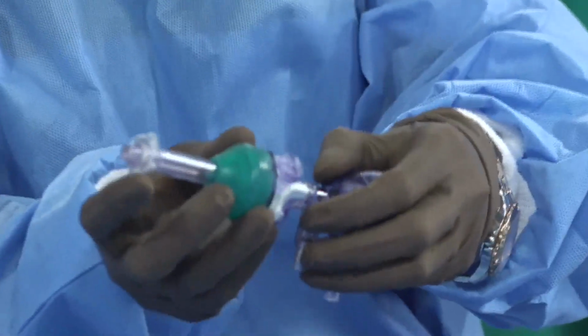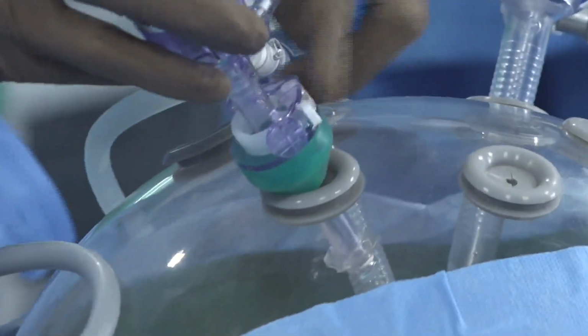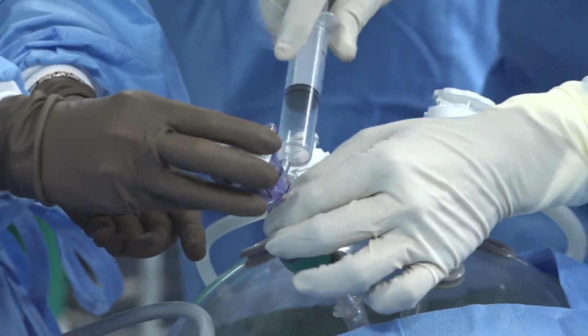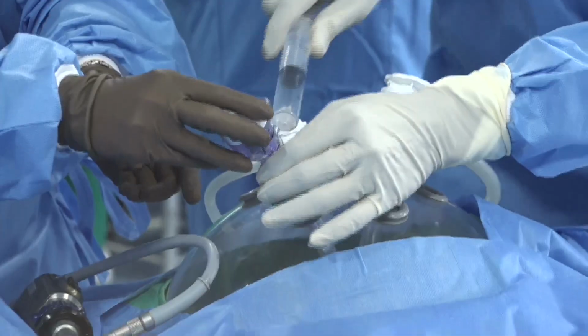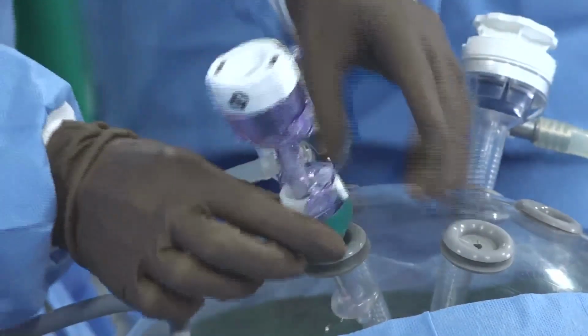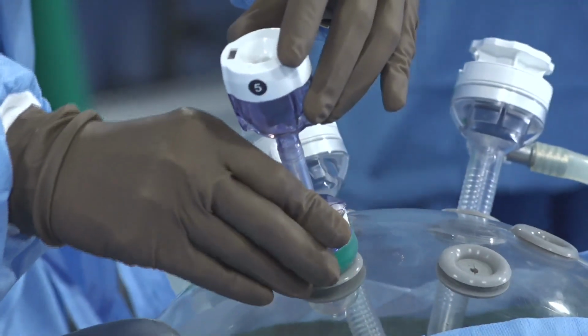So now, if you can see, this balloon has been deflated. Now we go inside the abdominal cavity, like that, and then inflate it. Okay. Can you go down? So the purpose is that we will pull it out, and this one also sits.